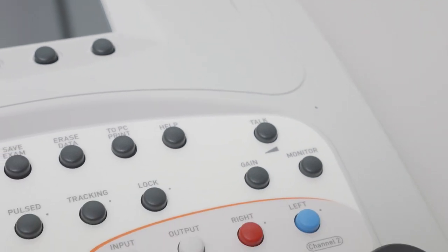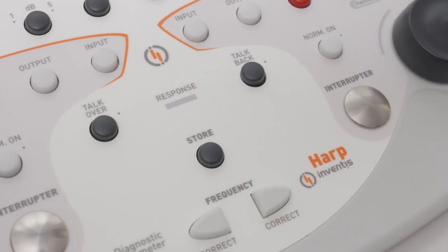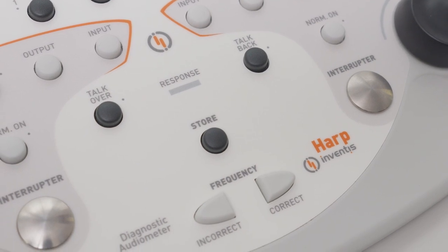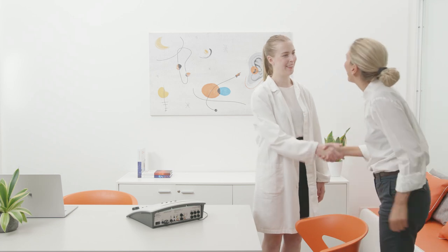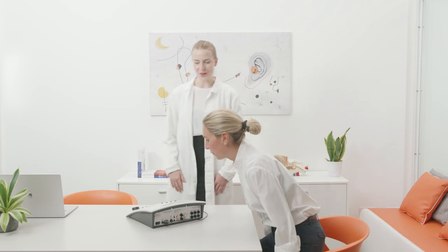HARP is an advanced diagnostic audiometer capable of performing fast and accurate air, bone and speech audiometric exams as well as several additional tests. Top-level features combined with ease of use and portability make HARP the ideal choice for a wide range of users, from hearing aid dispensers to audiologists, clinics and hospitals.